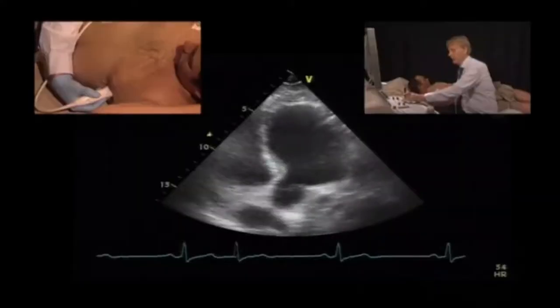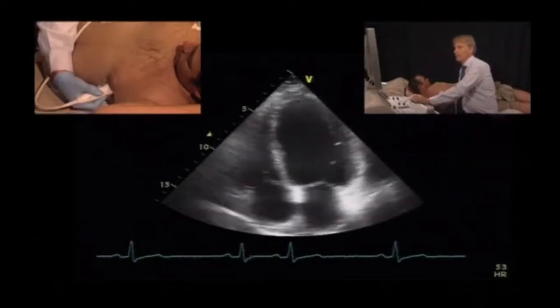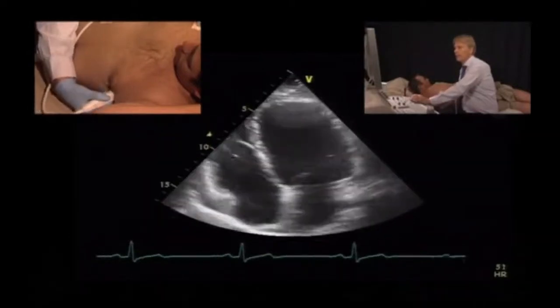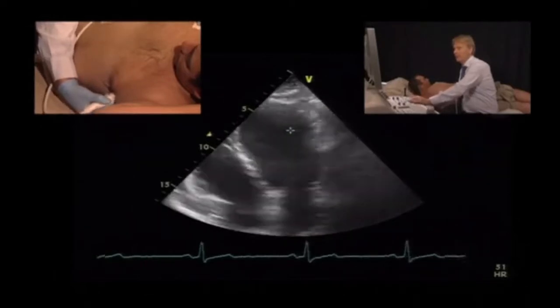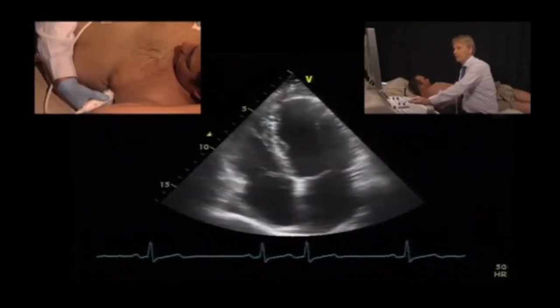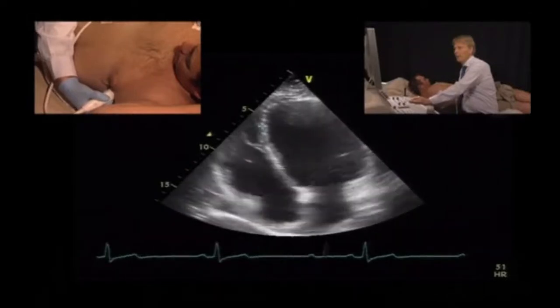Next, we'll take a look at the apical views of this patient, and keep in mind, always correlate the parasternal with the apical views. Let's take a look at the apical views. This is the 4-chamber view, and let's focus on the various segments, and you will appreciate that the distal septum here and the apex has a wall motion abnormality.